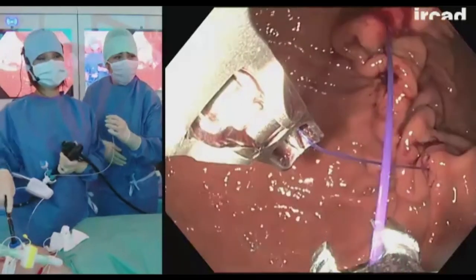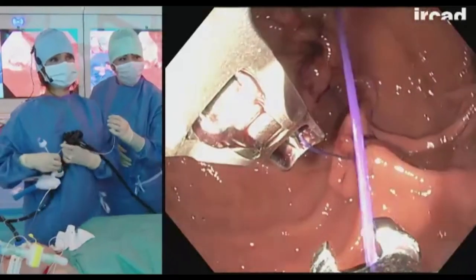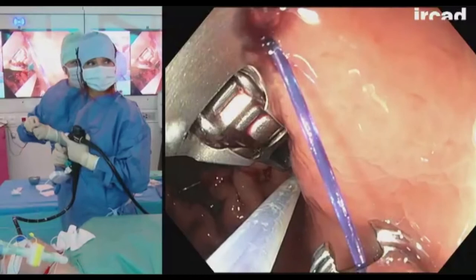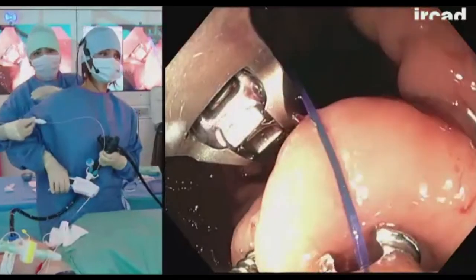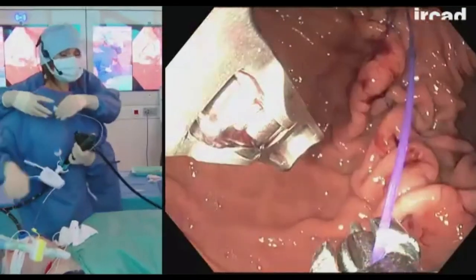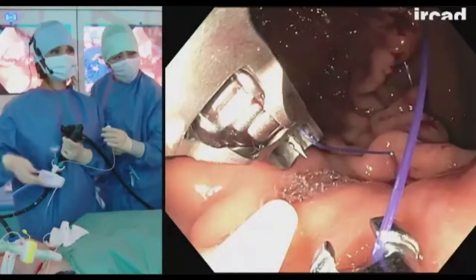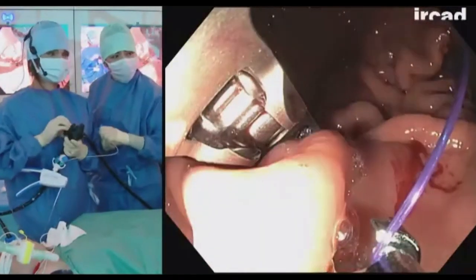I don't know what you think, Lee or Manuel. Well, Silvana, I just wanted to highlight to everybody that it really looks like a surgical suture line with no suture crossing. And it is amazing how it looks in a way that it's not random putting stitches all over, but actually you are following a surgical path as we are doing suturing over any surface. And yes, we use a mix of U shape and the square shape. I don't know what about Lee does now.